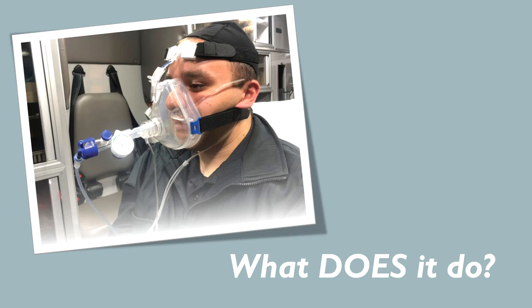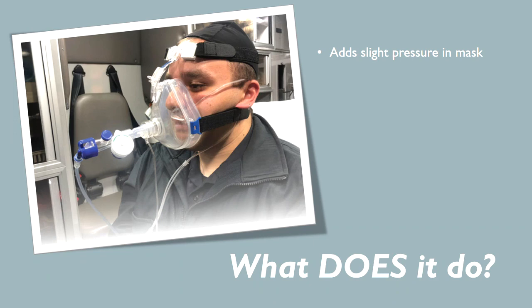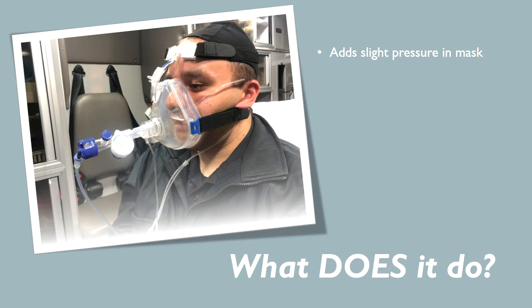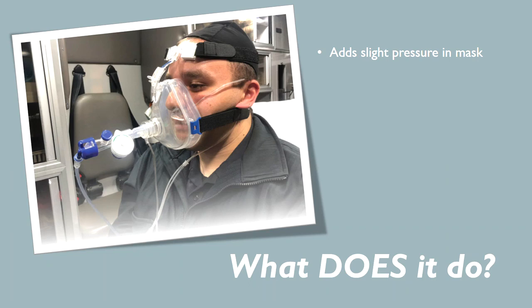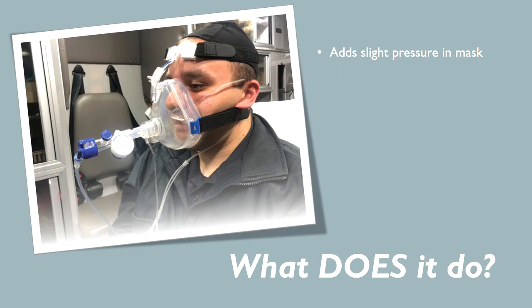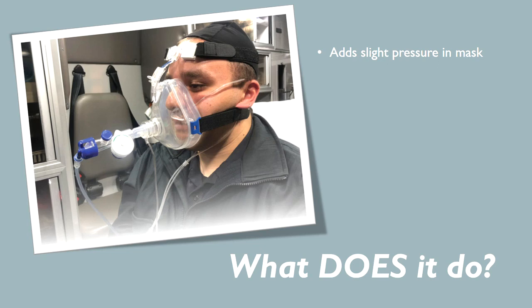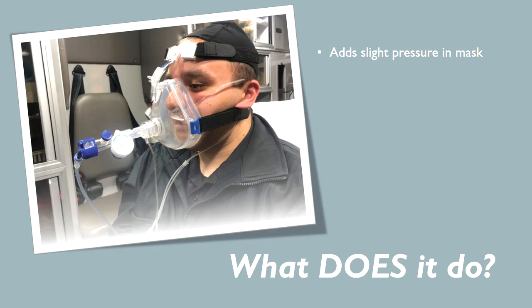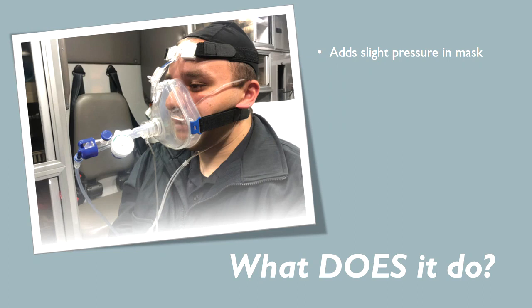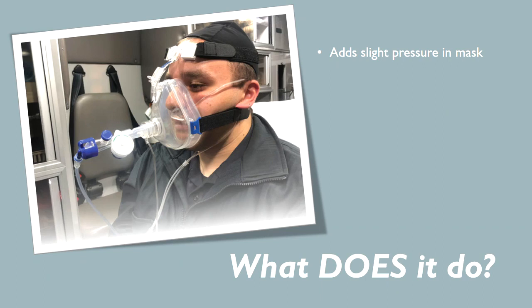CPAP does not ventilate our patient, but it does add a slight pressure into the mask. You can see the mask on this young man. Our body inhales and exhales to balance to the atmospheric pressure — the pressure in the air around us is what our body is always trying to balance to. So this mask, we put it on their face. It seals nice and snug — you can see there's a whole harness that holds it in a nice snug fit. We have to use the right size mask.